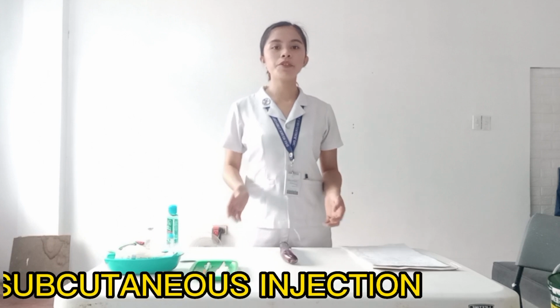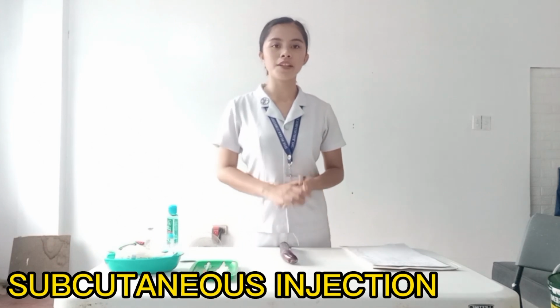So I will now proceed in administering through subcutaneous injection. Before we proceed with the actual administration of the medication, the first thing we would want to do is to check the doctor's order and the medication administration record. This is done so that we will be able to identify what drug is to be given to the patient.